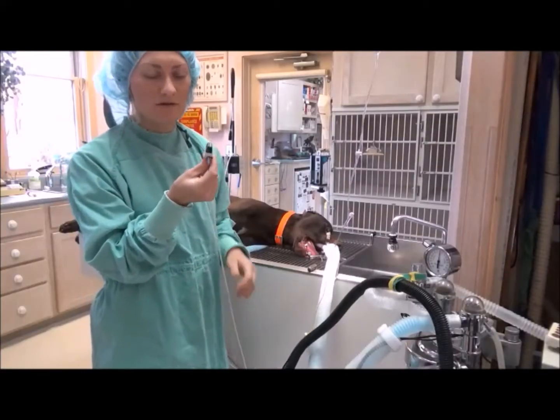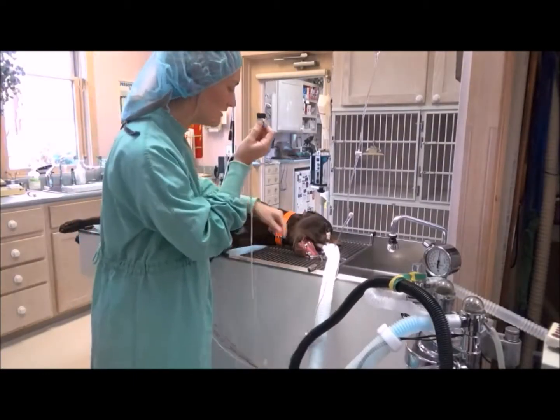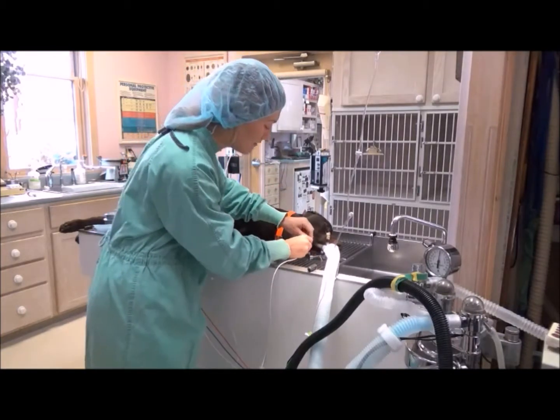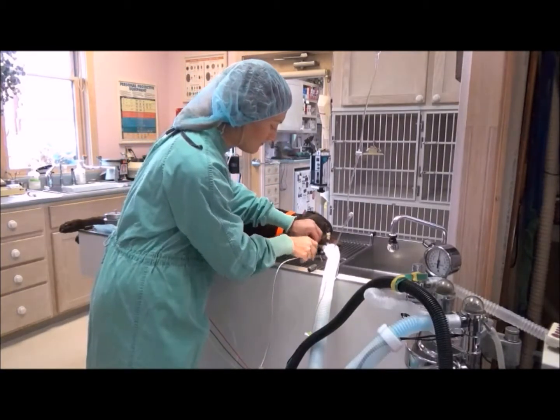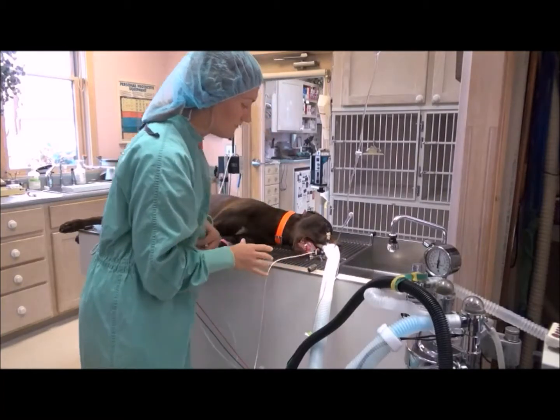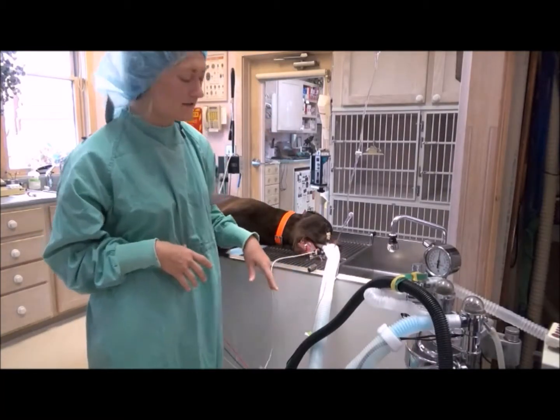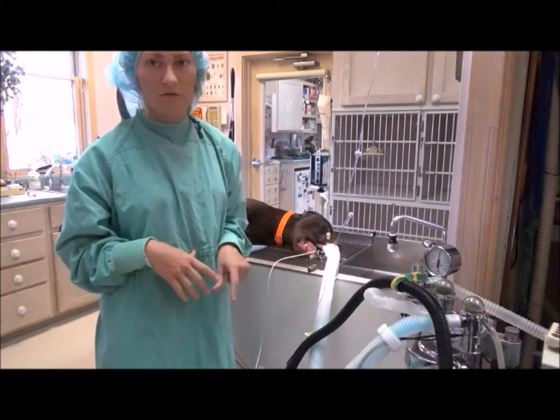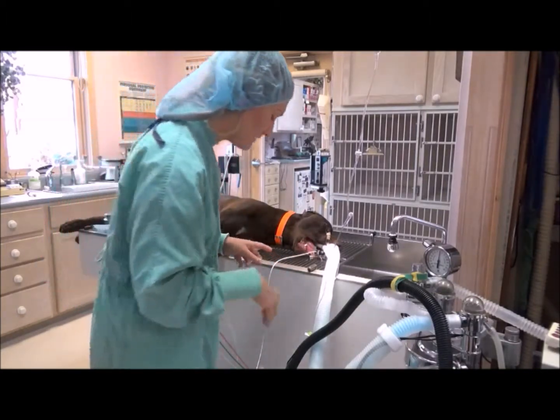Next, I'll place the pulse ox monitor on the tongue. You can place that on the tongue or on a pink paw pad. And that's going to detect the oxygen concentration of the hemoglobin. A normal number for that would be 95 to 100%.